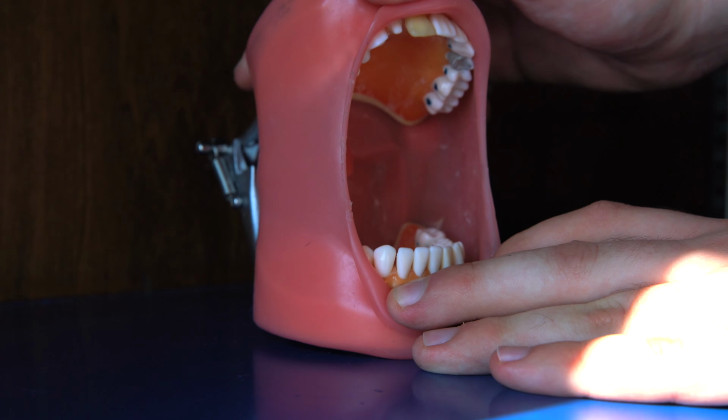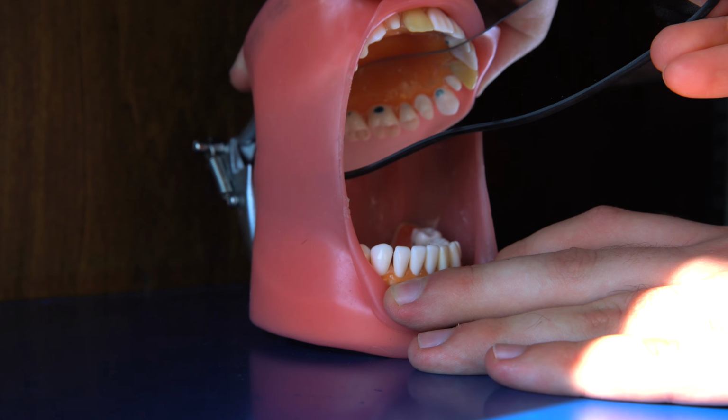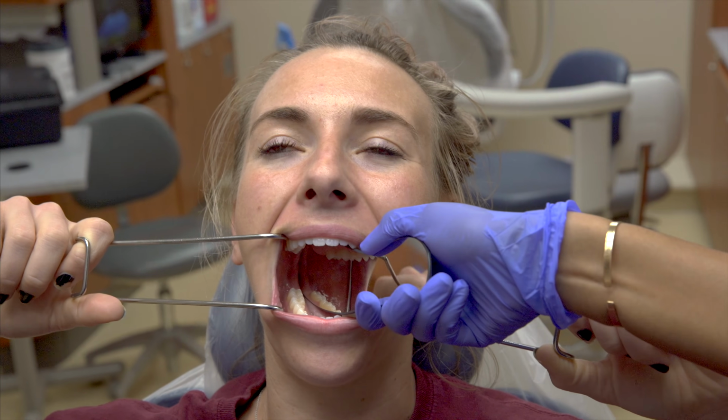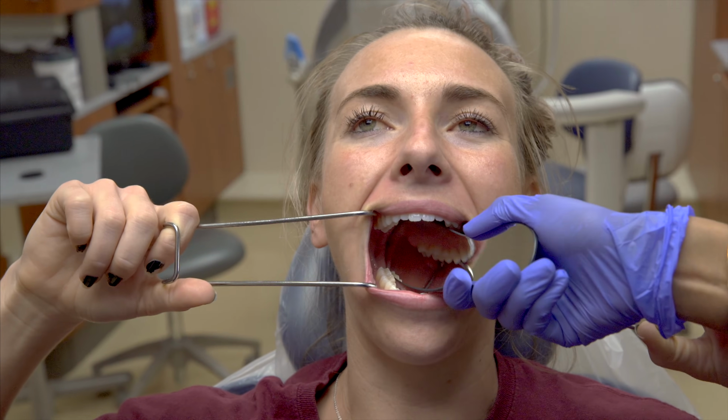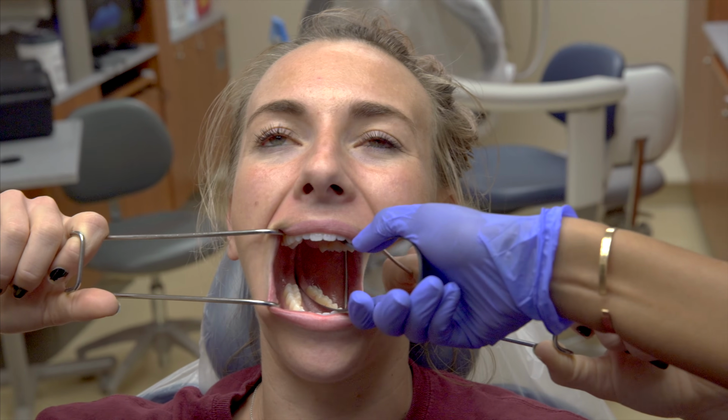For these shots, the assistant is usually on the opposite side as the photographer, so to minimize the amount of musical chairs, take the lingual of the maxillary teeth on the same side by just moving the mirror upwards. Just remember not to slant the mirror too much.